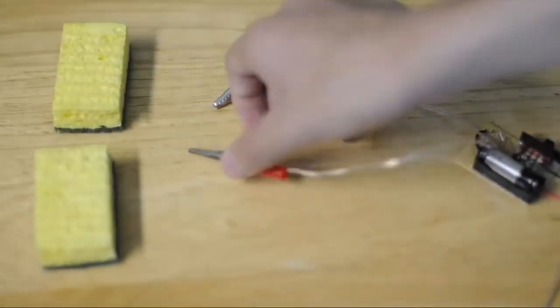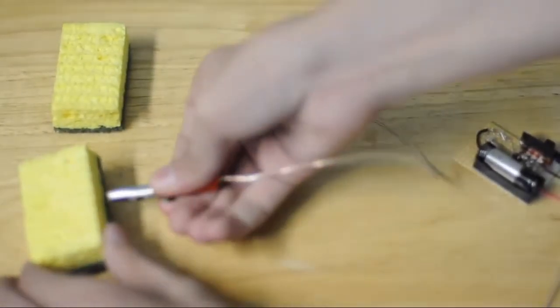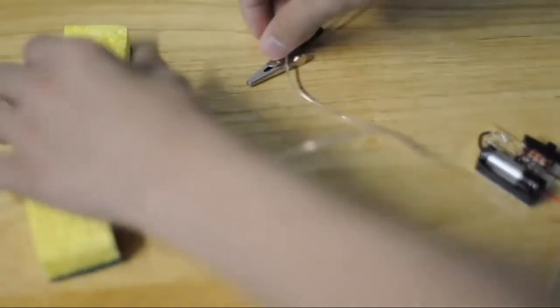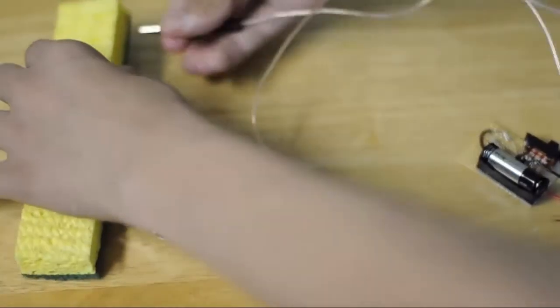Now that you have the wire attached to the alligator clip, all you need to do next is connect it to the sponge. Now make sure you do this very tightly so that the electricity actually transfers.